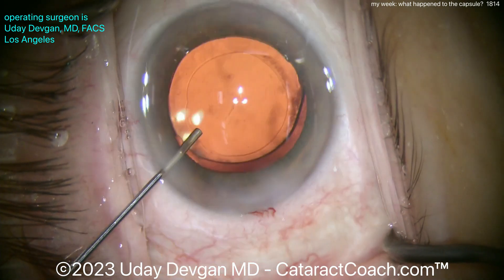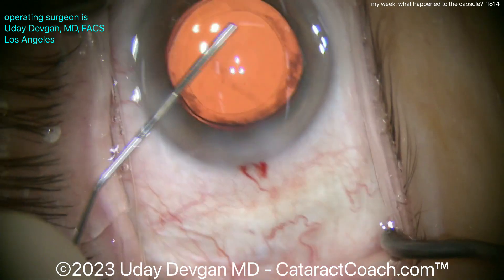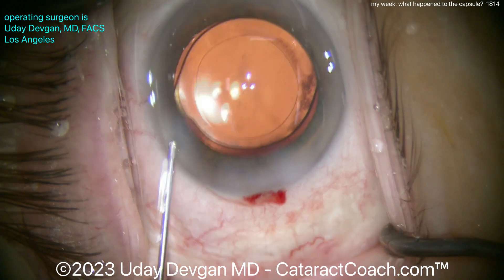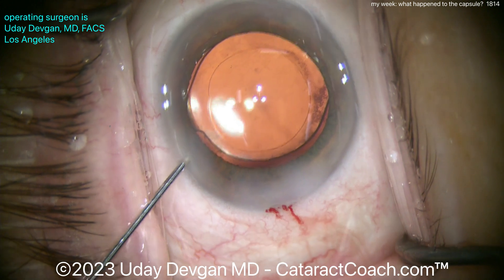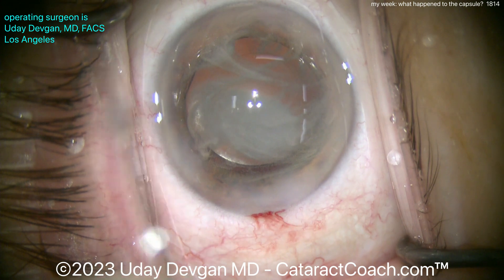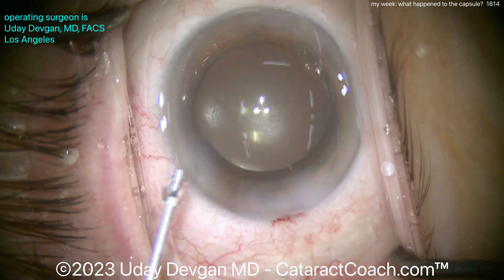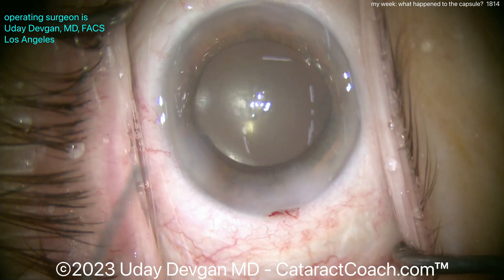Let's seal up the main incision — just a mild amount of hydration. Going in to make sure the lens is stable, hydrating the paracenteses, squirting into the angle to make sure there's no retained viscoelastic. A little triamcinolone to help quell that inflammation in the post-op period — we want this eye nice and quiet, especially because there's a tiny bit of lens material that got behind the posterior capsule. Good pressure there at the end of the case.